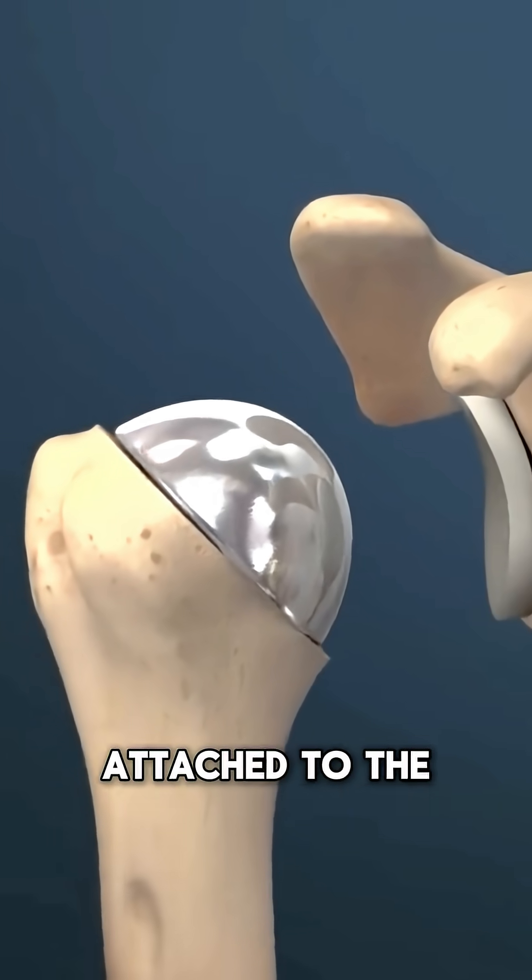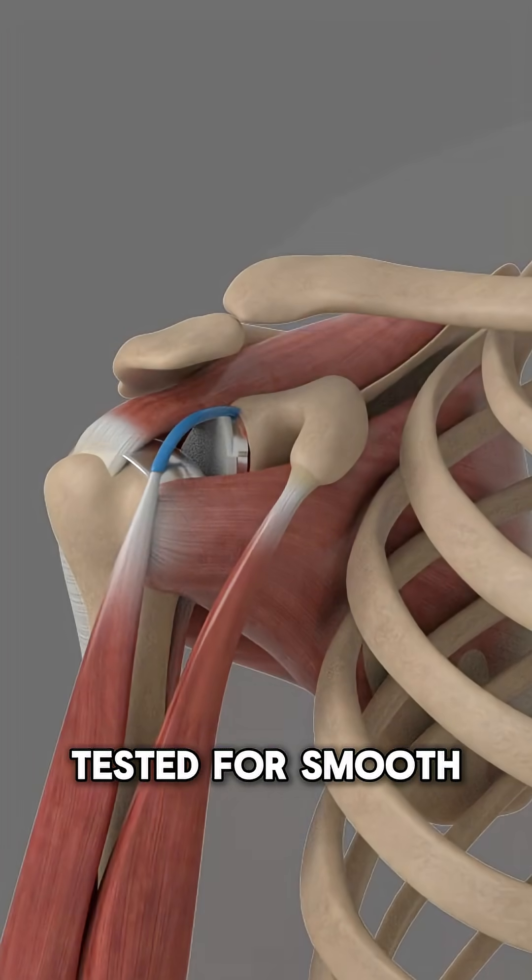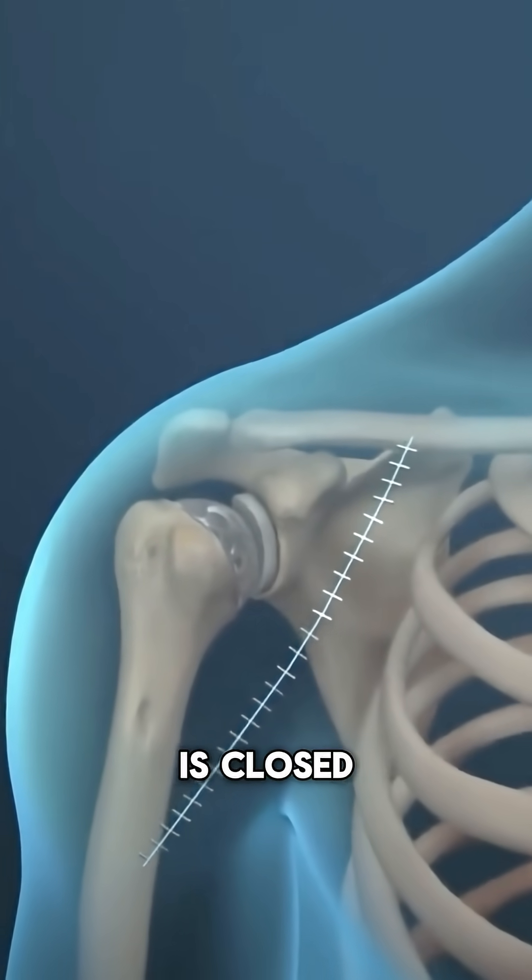The new ball attached to the humerus is placed into the newly lined socket. The joint is tested for smooth movement, then the incision is closed.